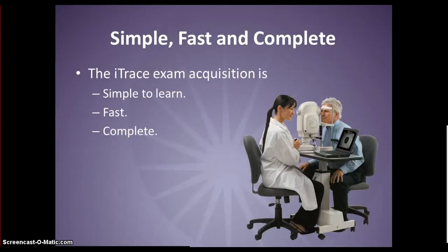So as you can see, the process of capturing patient information with an iTrace is simple, it's fast, and it's complete. Most technicians tell us within an hour or so they begin to get comfortable acquiring patient exam information. The process of taking a patient exam is very fast.